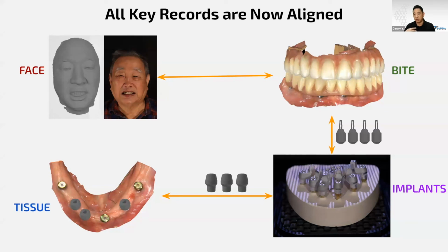With photogrammetry or any other fully digital or modelless type workflow, you're kind of stuck with using the tissue as common data between the bite scan and the tissue scan. And so that tissue, because it could move around, because it could change, is not always perfect, and aligning those can be very difficult. So having these rigid markers, basically these rigid scan caps, between all these different scans gives you the ability to align this data a lot more accurately and a lot more easily, frankly.